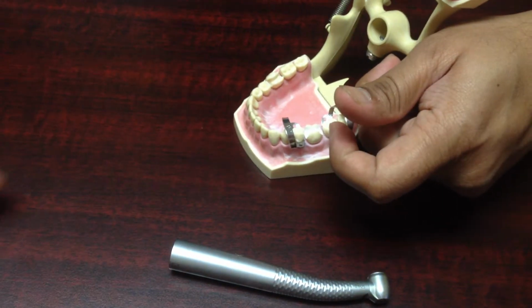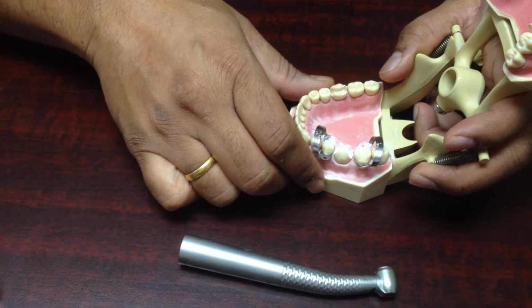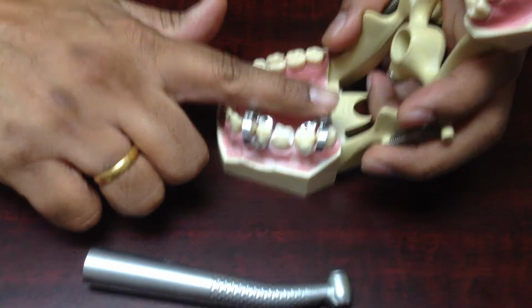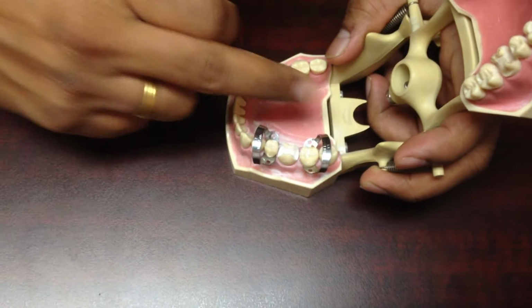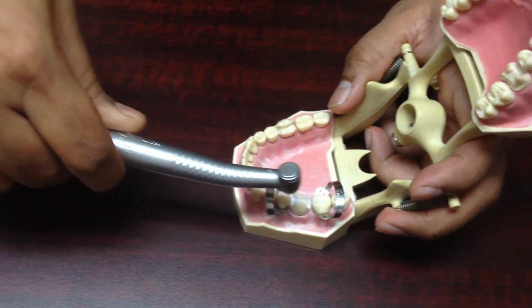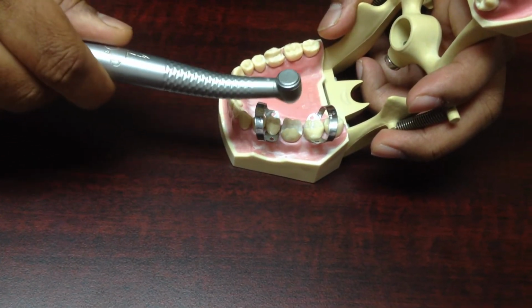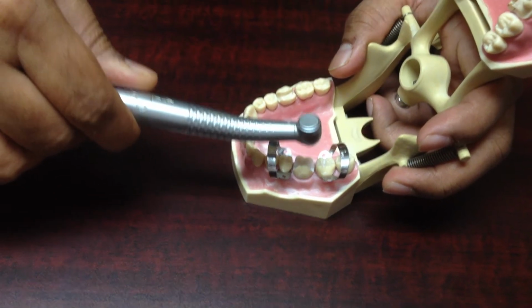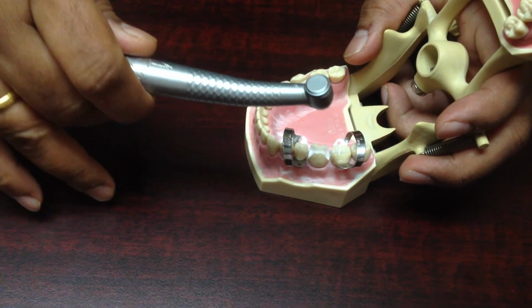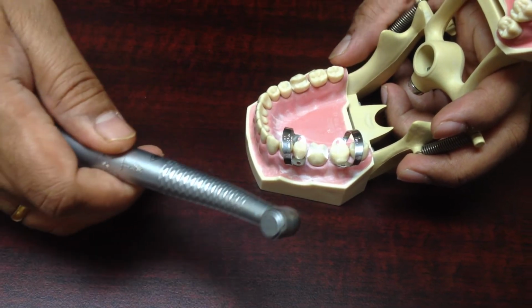And again, there will be additional hardware, but this is the part that will need some creative visualizing. Right now these are two clamps, but across the clamps there'll be rails, and then this would have some sort of an engager, the drill, that you can slide and engage into the rails. And then, again, the whole system is based on it being able to be fixed onto the dentition, the teeth. So when it scans and when it prepares the teeth, it's in the same plane, because that's very important, as you can imagine. Otherwise, it'll cut the teeth all over the place.